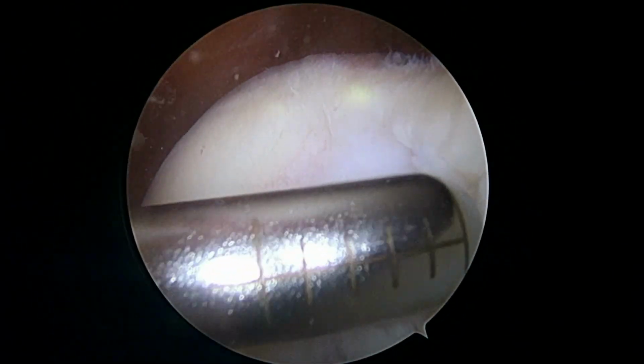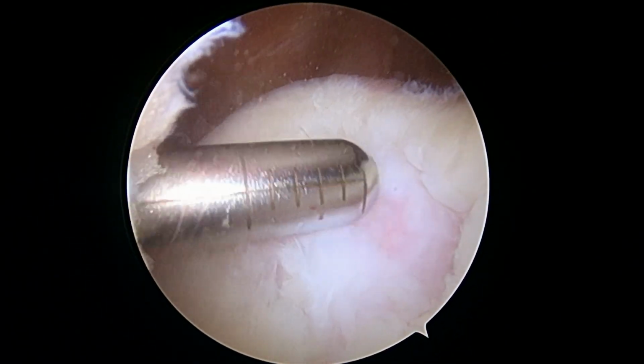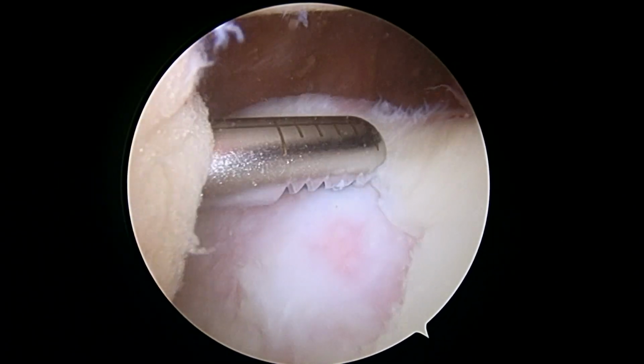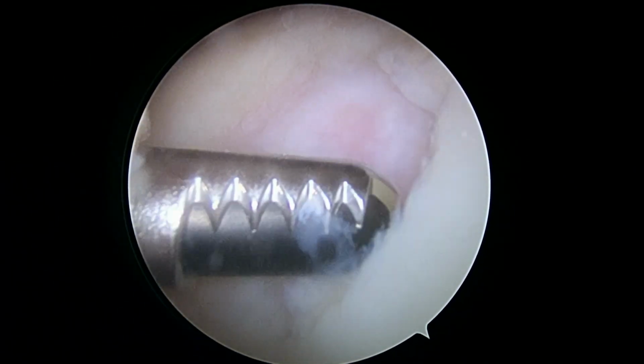Okay, so here we can kind of measure the defect here. Looks like it's a couple centimeters across. Maybe 1.5 that way. And at least 1.5, if not 2, from anterior to posterior.